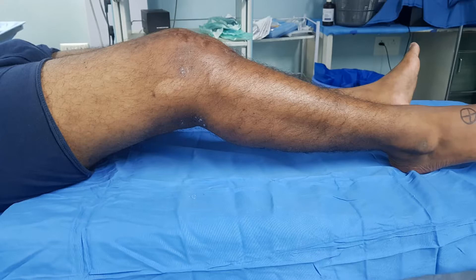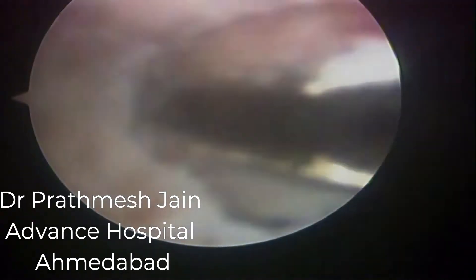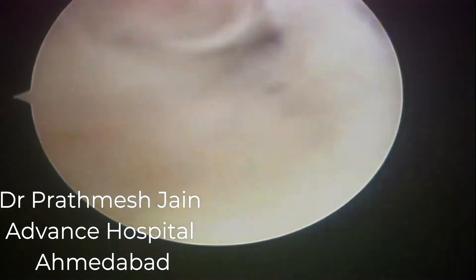This was the condition of the patient when he presented to us. The range of motion was a mere 20 degrees and the knee was absolutely stiff. Patellar movement side-to-side was absent. We started with an arthroscopic procedure to treat this condition. Initially we were a little hesitant whether this much stiffness could be addressed with arthroscopy, but eventually it worked out well.